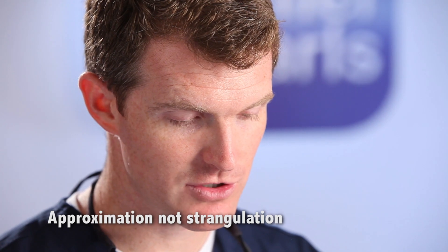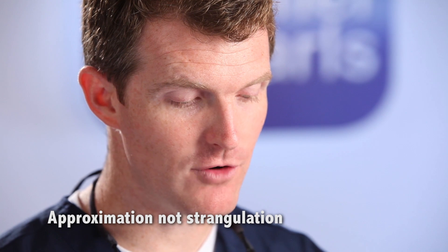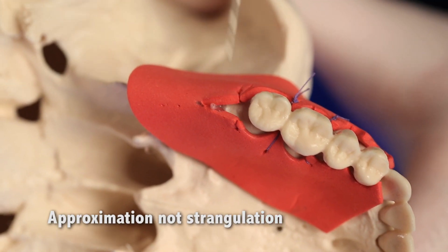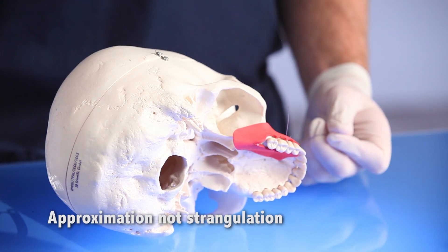How do you know how tight you should be suturing? Experiment with 5-0 chromic gut. This suture material snaps if you're tying too tight, so it's a good way to estimate the right amount of tension for general suturing. The goal is approximation, not strangulation.